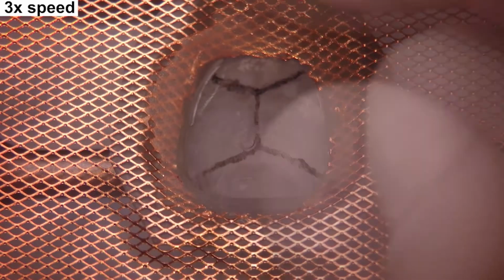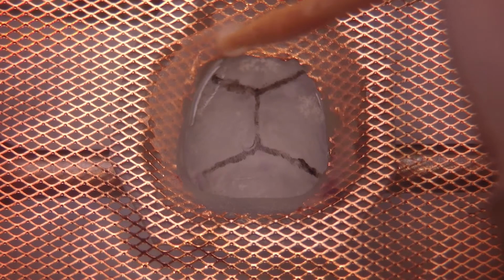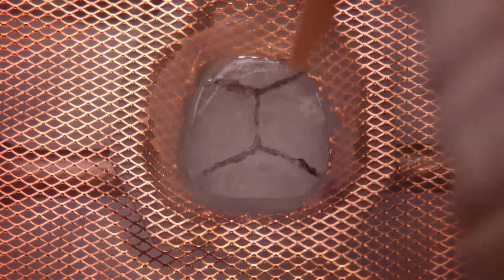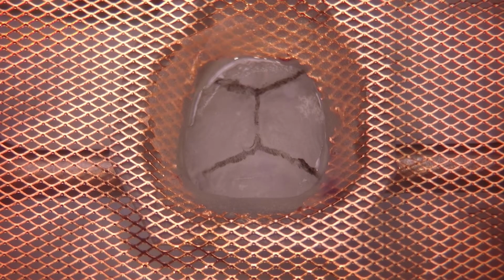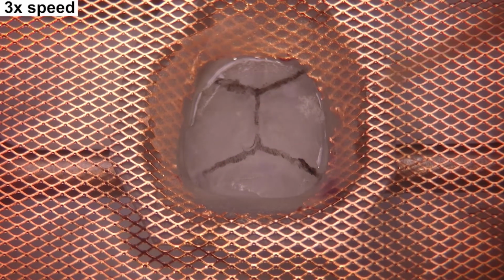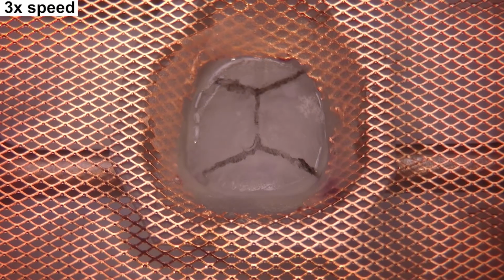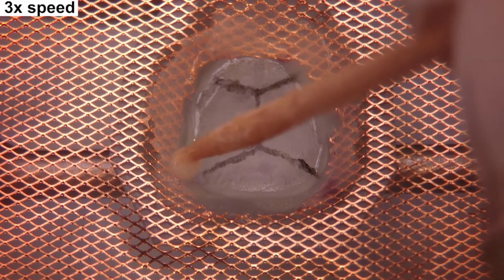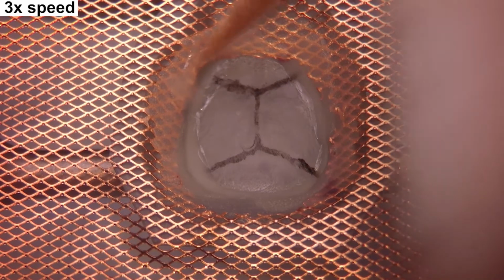So once we have a temporary connection, then we can apply quite liquid cement all around. And the purpose of the really liquid cement is to let it flow between the base and the skull. Basically we want to create, again, a watertight seal between our copper mesh or plastic base and the skull. Because if there is any tiny hole in this, then tissue fluid can leak into this skull, and it can create some unwanted noise issues during the chronic recordings.